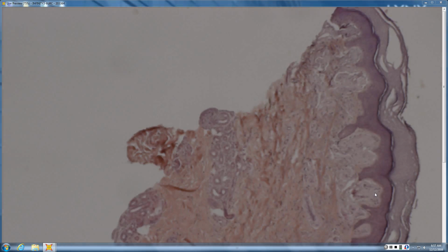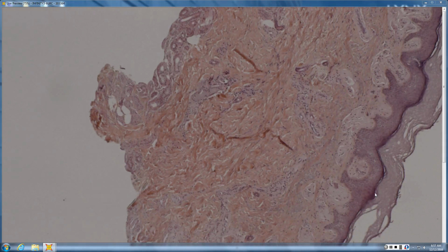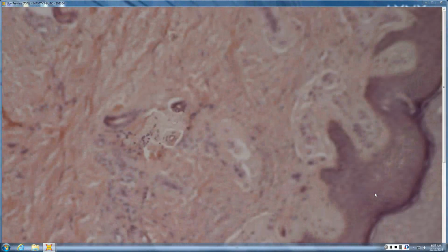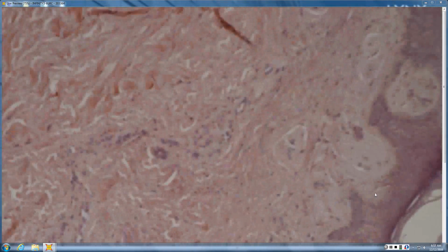So, number 4. There's a lot of, I guess, pink material. So, where is it situated? More so, I guess, papillary dermis. Papillary dermis, good. So, what does that make you think of? Is it cellular? No, not really, right? It's kind of that amorphous, acellular, eosinophilic material.